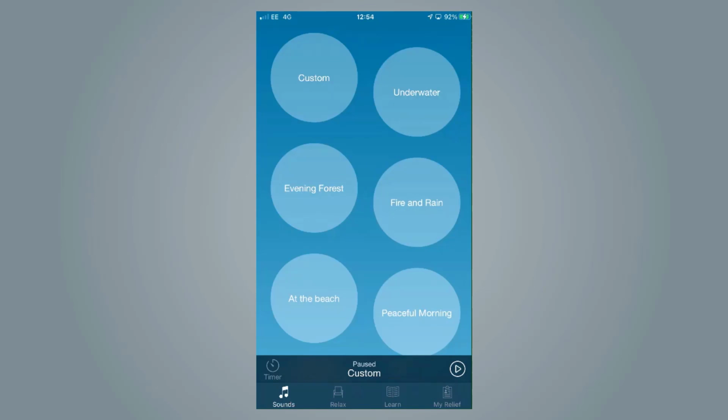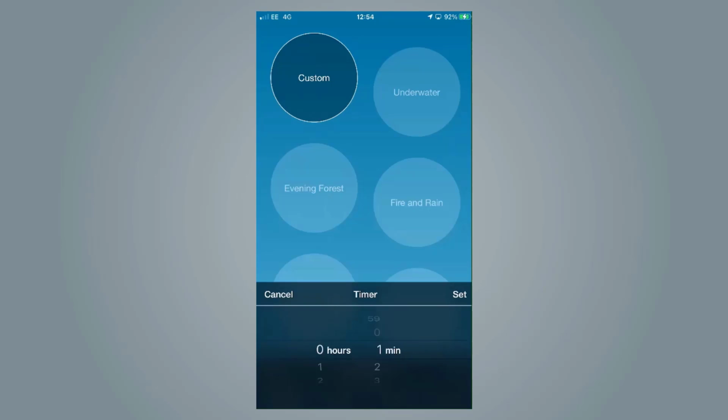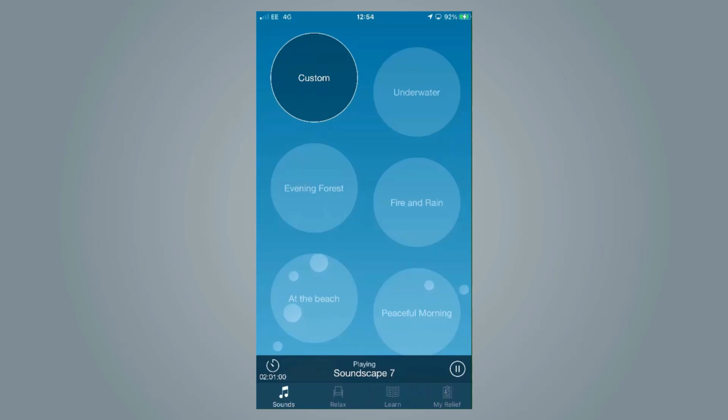What you can also do, once a setting is playing, is set a timer for when you want it to stop. For example, if somebody needs this to help them get to sleep, they can simply press play, click timer, and set it to dismiss after 2 hours.